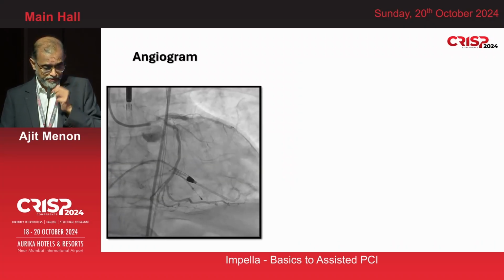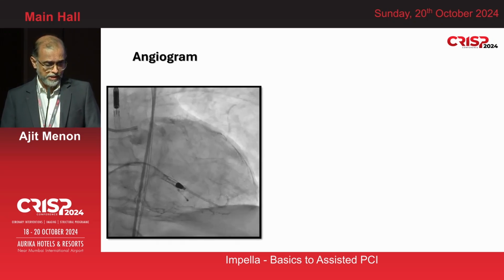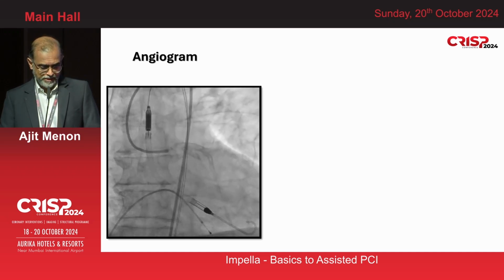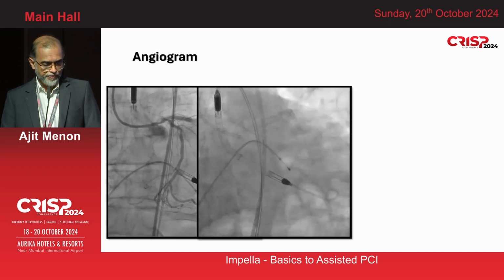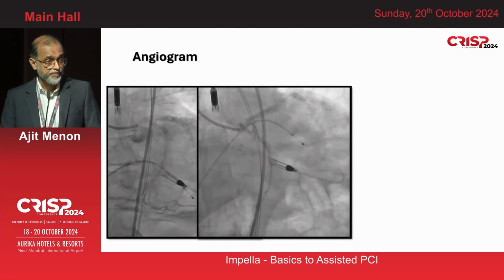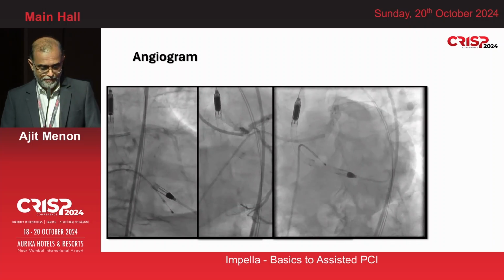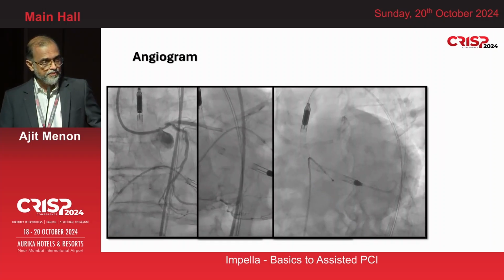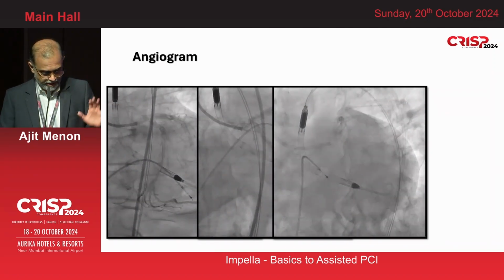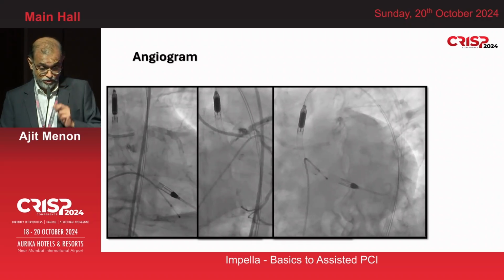I'll show you the angiography findings and the reason why we went upfront with the Impella. This was the coronary angiographic finding: a critical left main disease, totally occluded LAD, heavily calcific vessels, calcific circumflex, dominant circumflex. This was a situation where we would definitely like some support. After institution of the Impella support, we involved our heart transplant team in the Impella decisions and placement also, and they are hand-holding us throughout the procedure.